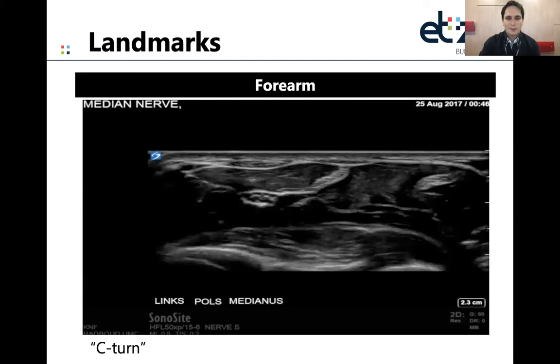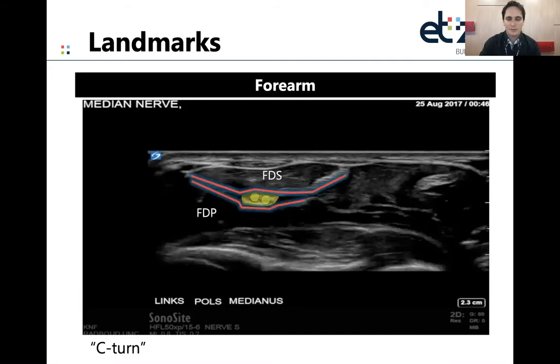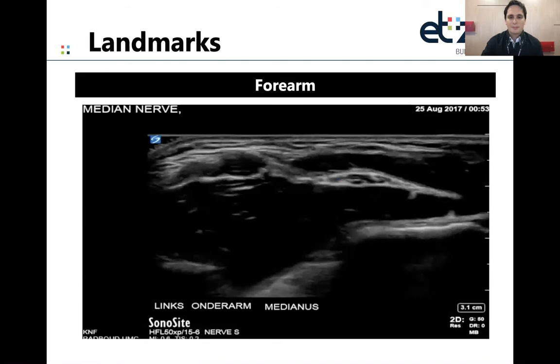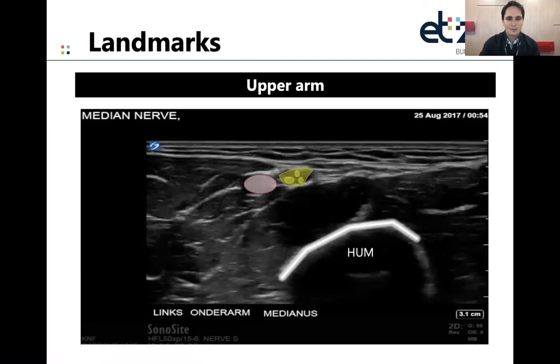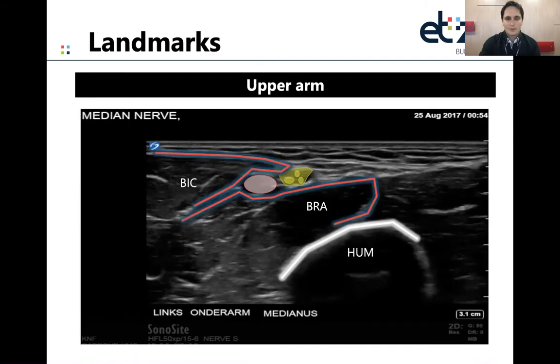When visualizing the median nerve more proximally, it will make a C-turn which I will demonstrate in the live demo. It runs a deeper course between the superficial flexor digitorum muscle and the profound digital flexor muscle. Even more proximally, the median nerve runs a more superficial course again, going to the surface between the two bellies of the pronator teres muscle. In the upper arm, the most easily recognizable landmark is the brachial artery, which is always next to the median nerve, and you can also identify it between the biceps and the brachial muscle.